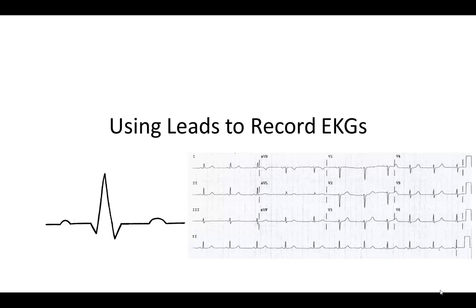To answer this question, we need to understand how exactly the whole system of taking an EKG and getting the recording is actually set up. So let's go to a situation that's a little bit simpler. Let's say we have a box, and inside of the box are some charges, and the charges are moving around. But now let's say that we don't actually know what is happening inside of the box. So we know the charges are there, but we just don't know which way they're moving.